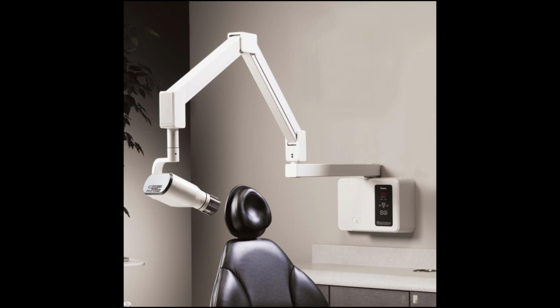Dental x-rays are digital images of the hard structures in a mouth that are used to evaluate oral health. Low levels of radiation are used to capture images of the interior of the teeth and jawbone. They allow us to see the things we cannot see clinically.